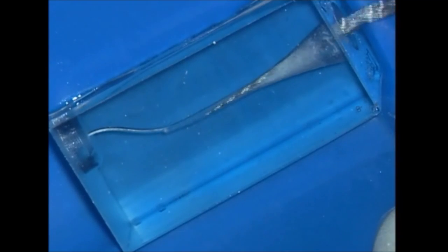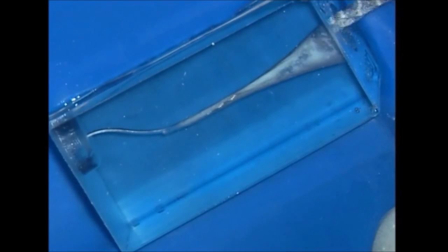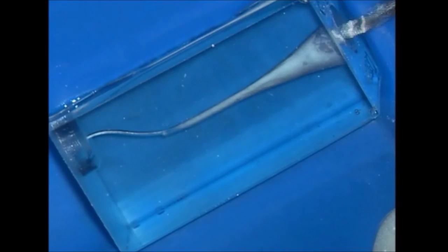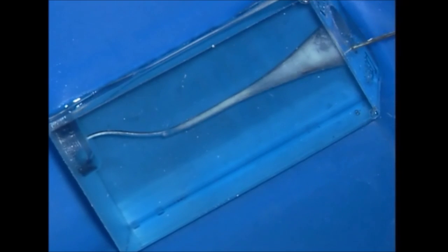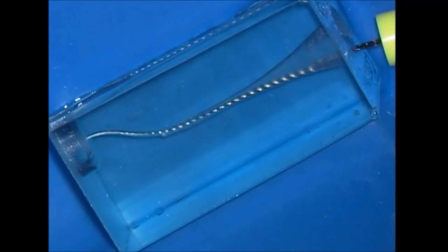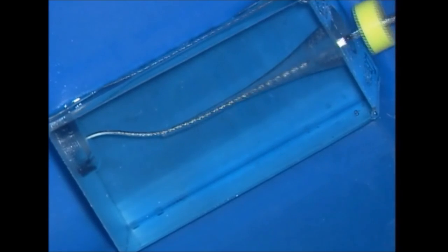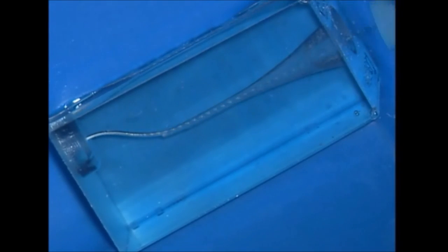We use a ProTaper Shaper 1 to flare and brush cut the coronal portion of the canal and improve access. This generates quite a bit of debris and necessitates continuous irrigation procedures after each rotary instrument. With improved access, the small pre-curved hand file is free now to go to length. It's worked repeatedly in short amplitude strokes until it is loose. Irrigate, recapitulate, and re-irrigate.